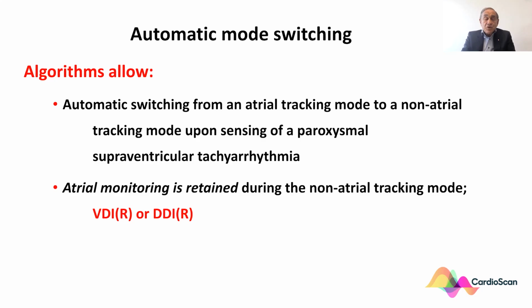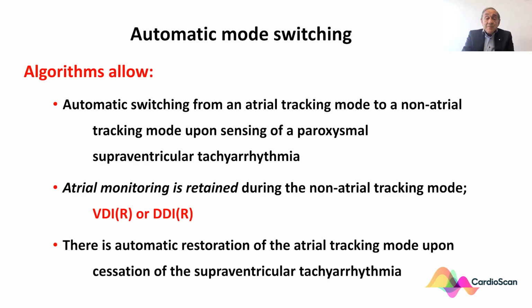And this is generally two modes, VVI, or because there is sensing in the atrium, VDI, or there is DDI, where there is no tracking, but there is, as I stated earlier, atrial sensing. There is automatic restoration of the atrial tracking mode upon cessation of the supraventricular tachyarrhythmia.